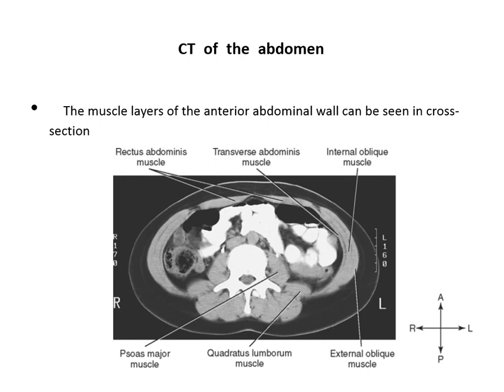On CT of the abdomen in cross-section, we see the muscle layers of the abdomen lying anterolaterally: the outer external oblique, the middle internal oblique, and the inner transverse abdominus. In the midline on either side is the rectus abdominus muscle, with the linea alba between them, and the linea semilunaris. Posterior abdominal muscles include the psoas muscle on either side of the vertebral body, the quadratus lumborum posterolateral to it, and the erector spinae as the back muscle.